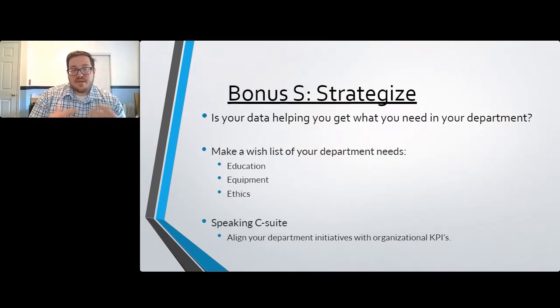When you present that in an S-bar or a data summary, you're giving them very clear, concise, lean data that's going to allow them to say to their bosses, to their leaders, hey, you know what? Our SPD, they came up with a great way to help meet market KPIs. We got to buy them this borescope. And when things are looked at on that level, not only are you helping your department, your organization, but ultimately it makes the patient safer.